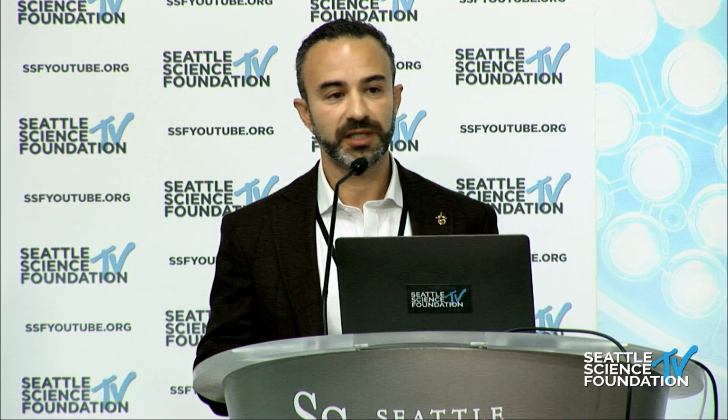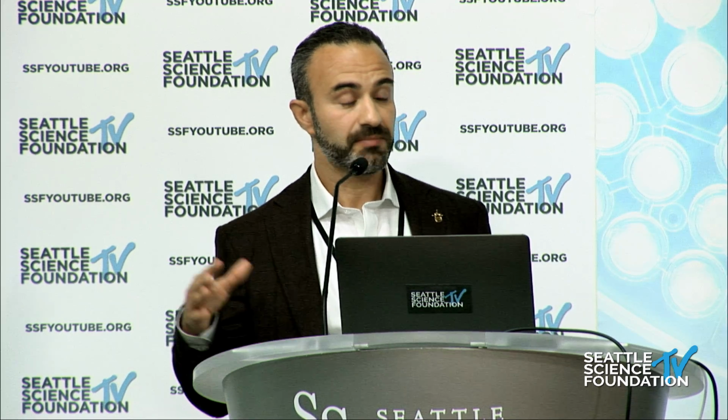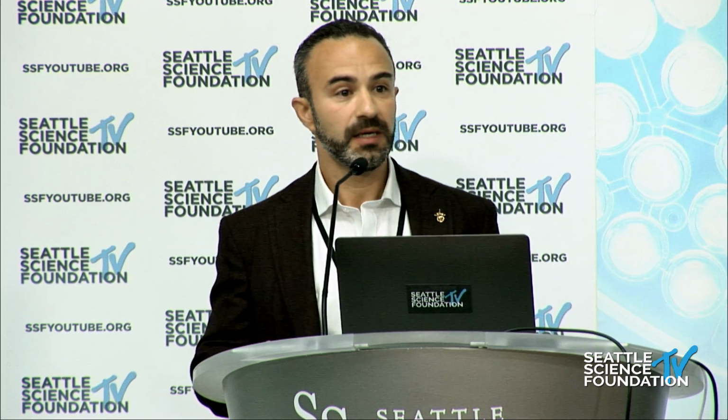Great question. That's absolutely a very, very important consideration. For example, in a patient that was already fused up to T10 very solidly, I'm a little bit less worried because I know there's sclerotic bone at L5-S1, and I'm putting a large bony interbody or maybe titanium interbody at that stage, and I'm fixing it to the pelvis. So I'm actually less worried in a patient like that. In that patient, we actually just added on to the mid-lumbar. So we used the existing construct, and I didn't even open the incision all the way to the top.